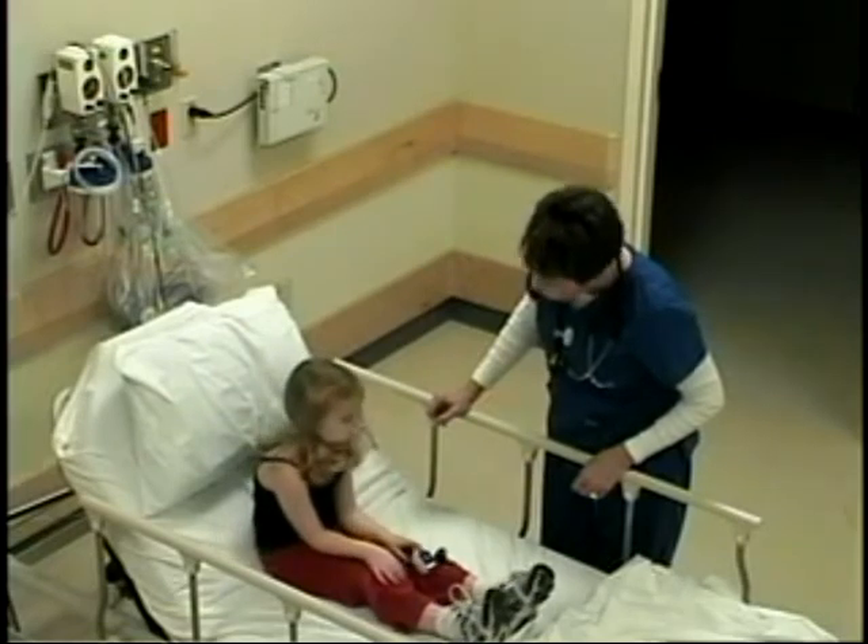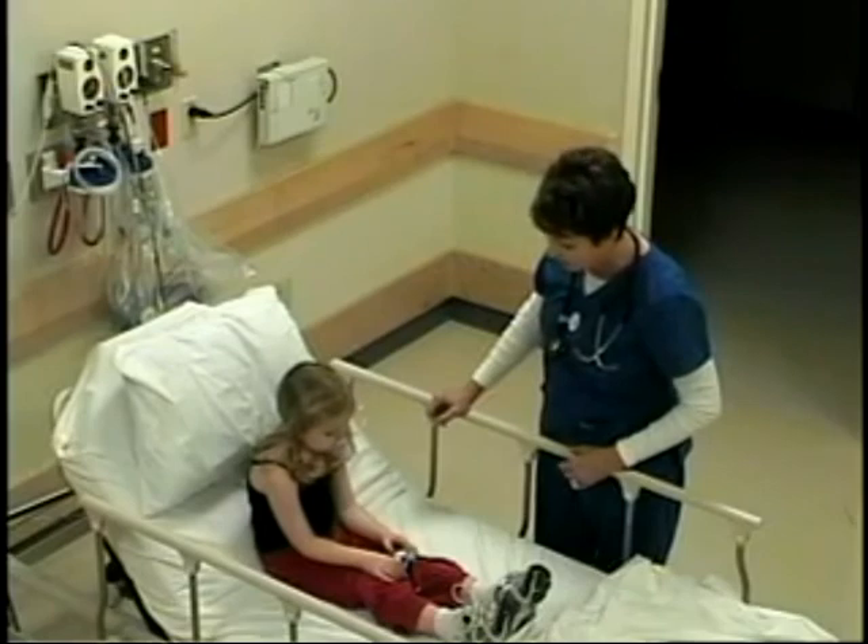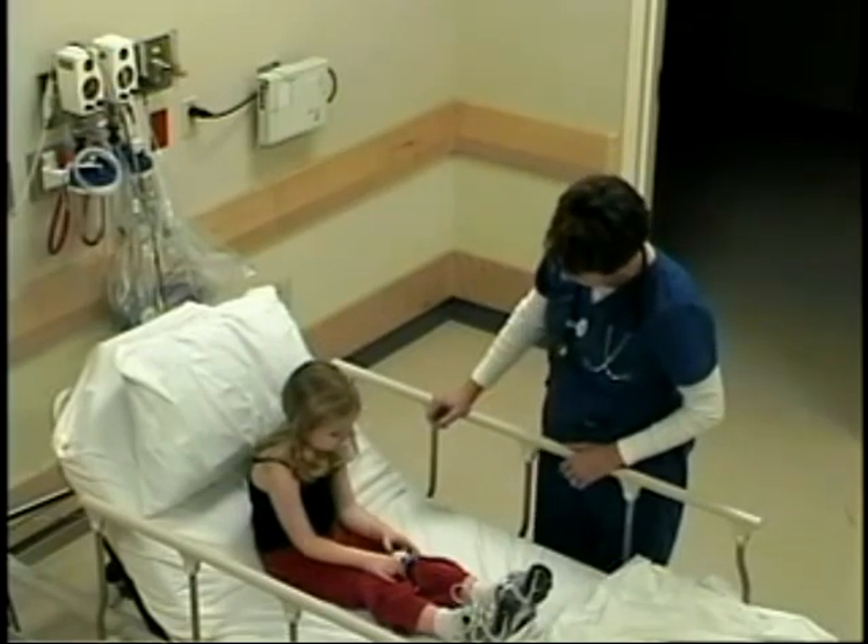Does that sound okay? You feeling a little bit better with the oxygen on? We can make you feel better — that's all right.